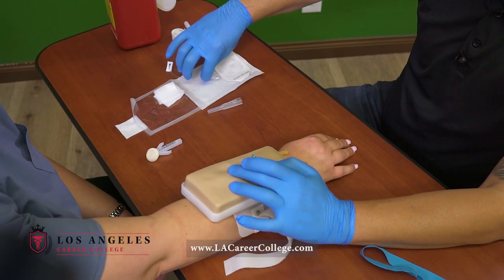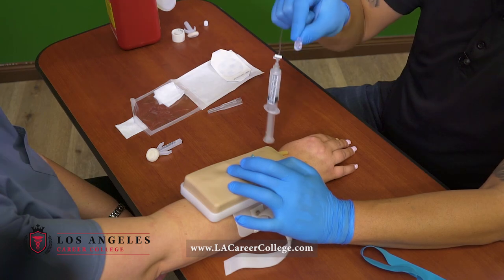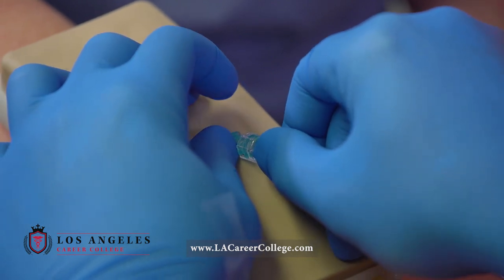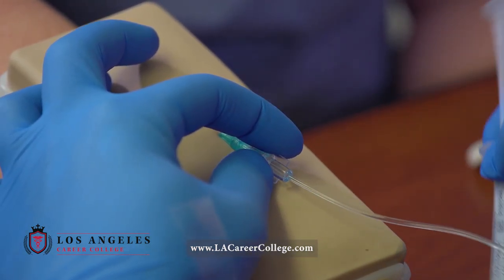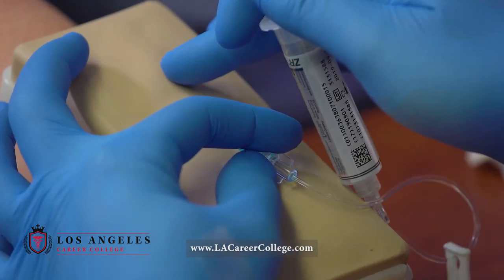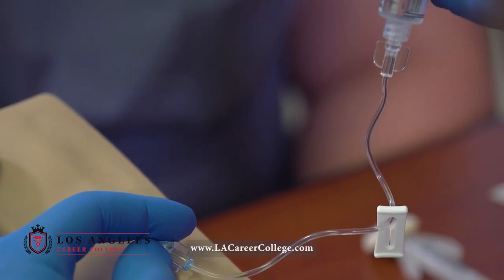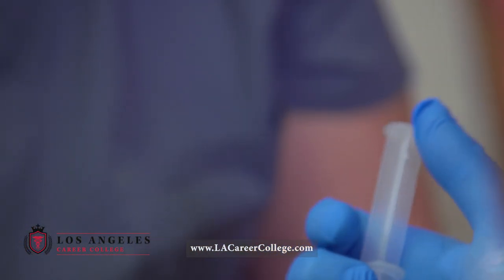I will grab my extension tubing and connect it. I will hold, let go of this finger to let the blood flow, and flush immediately to confirm my IV placement. I will assess my patient — Terry, are you feeling any kind of pain? No. That's awesome.